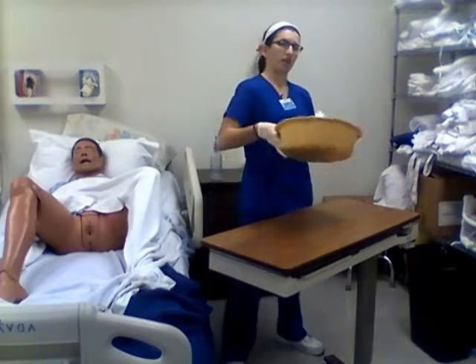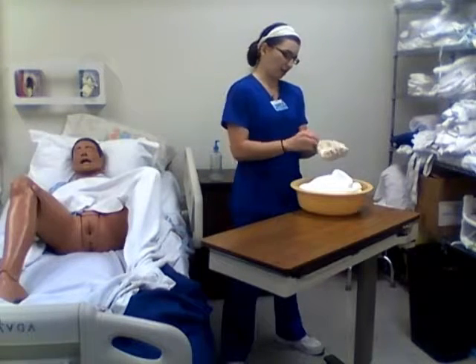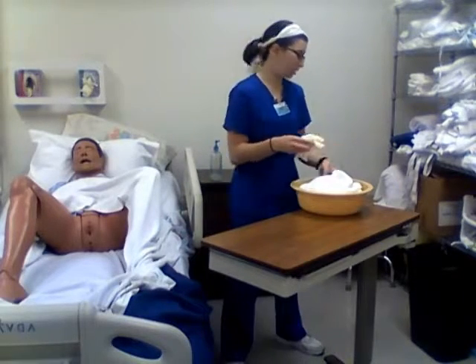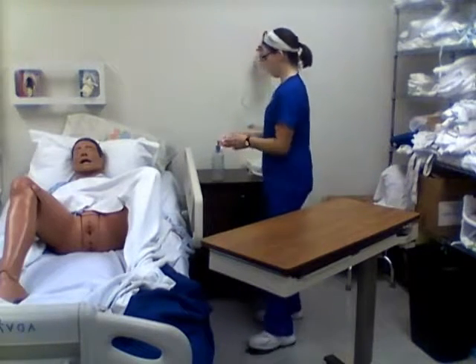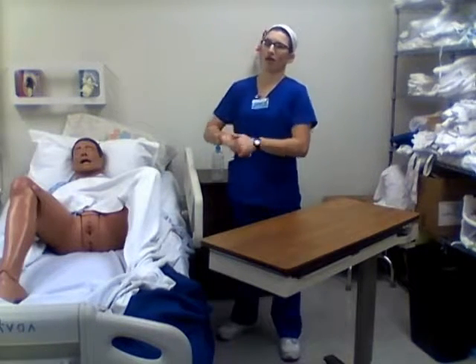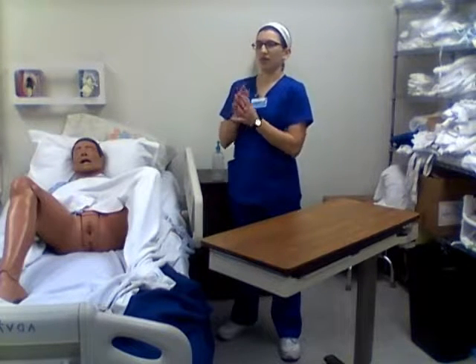In the laundry hamper, we can get rid of our bath basin, and we can also dispose of our gloves while we're at it into the trash can. All right. So I'm going to go ahead right away after I take off my gloves, I'm going to perform hand hygiene once again.